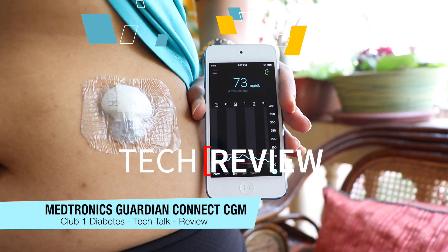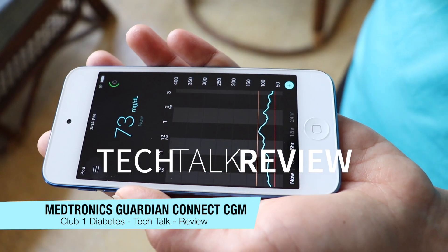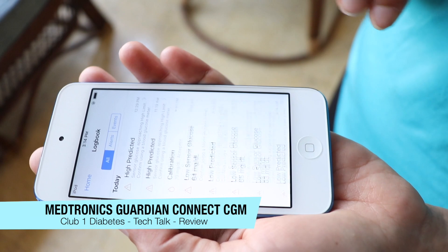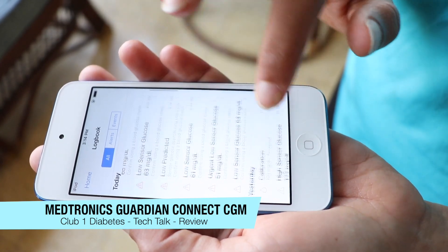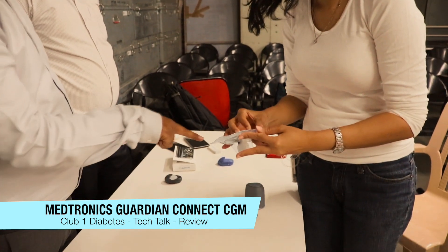Hey everyone, welcome to Club One and another episode of Tech Talk. We're going to be reviewing Medtronic's Guardian Connect CGM today. Here's the companion app that talks to the CGM on your body — it shows you your blood sugars on your phone in real time and gets updated every 5 minutes. It's got a pretty friendly and cool user interface too.